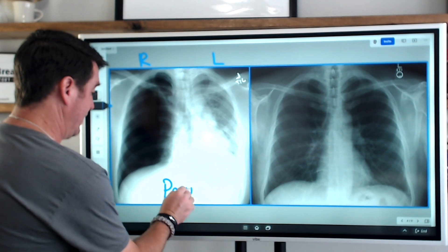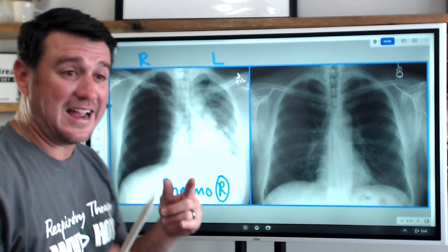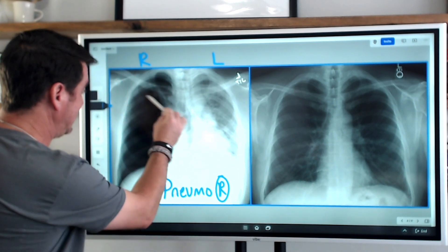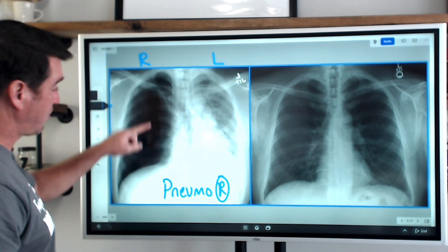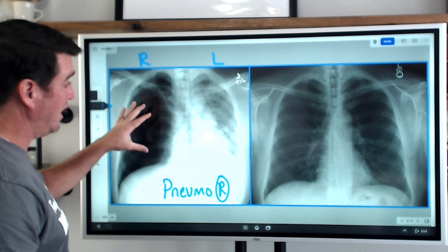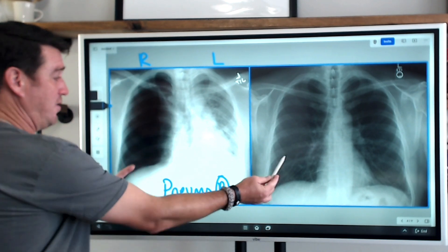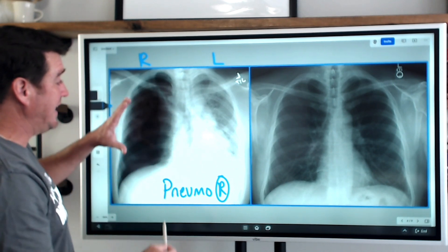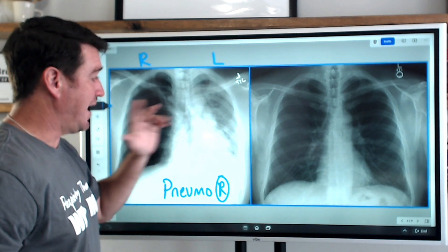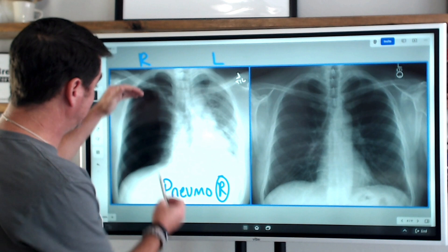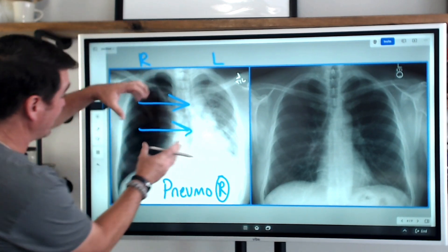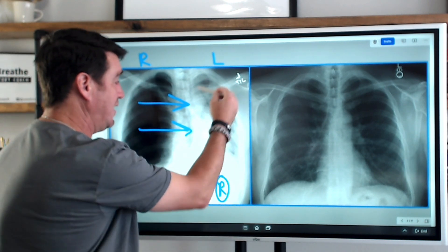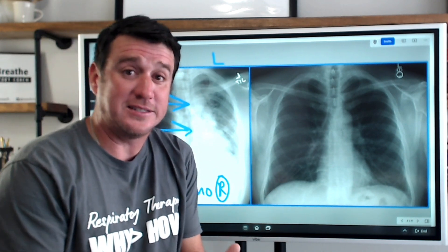The reason I know that is because when I look at this lung field, I see that it's extremely hyperlucent and there are no lung markings present. That tells me that the lung that is supposed to be over here is not there. It is pushing everything over — air is coming into the pleural space and moving everything across. The fact that this air is compressing everything over is why the left side of the lung field appears more radiopaque — it's being squeezed by the air in the pleural space on the right.